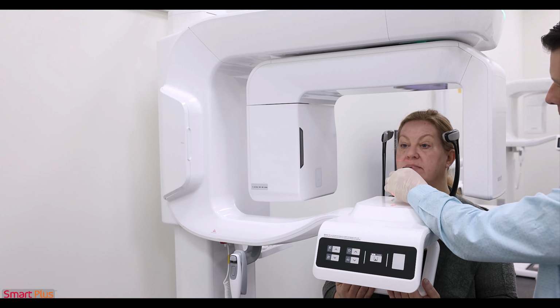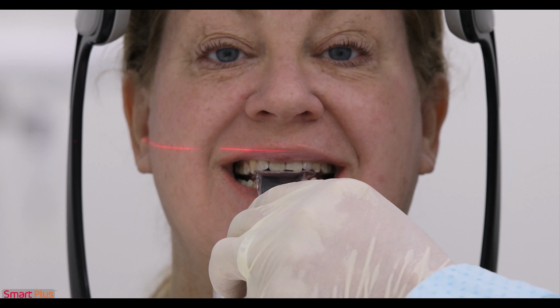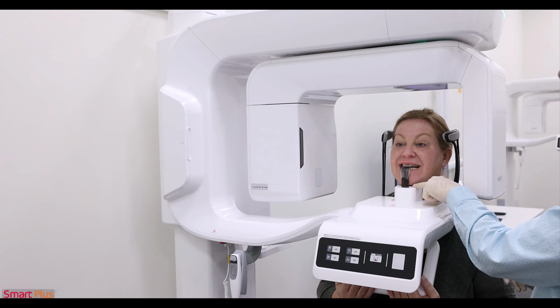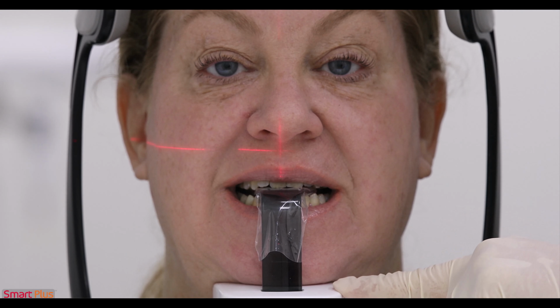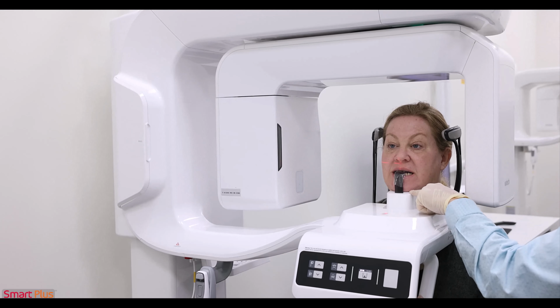Then I'm going to have the patient go ahead and open and bite on the bite stick and smile really big for me, and I'm ensuring the patient is biting in the bite stick groove. And you can see there's a little space here underneath her chin. I'm going to go ahead and gently push down on the chin rest to ensure that the patient's chin is firmly on the chin rest here. And that was just gently pushing down on the bite stick here.